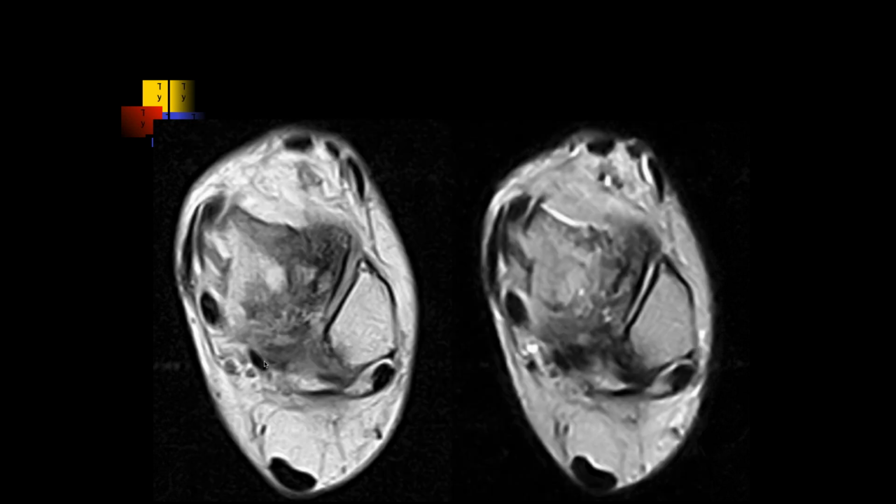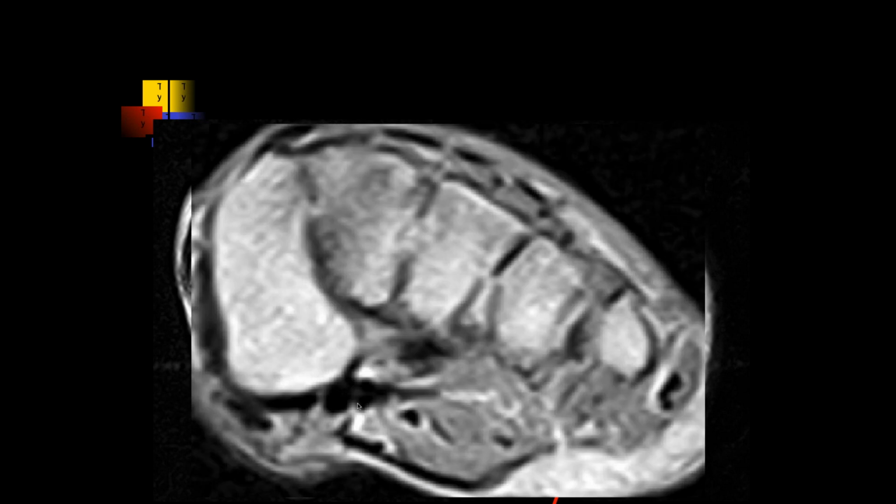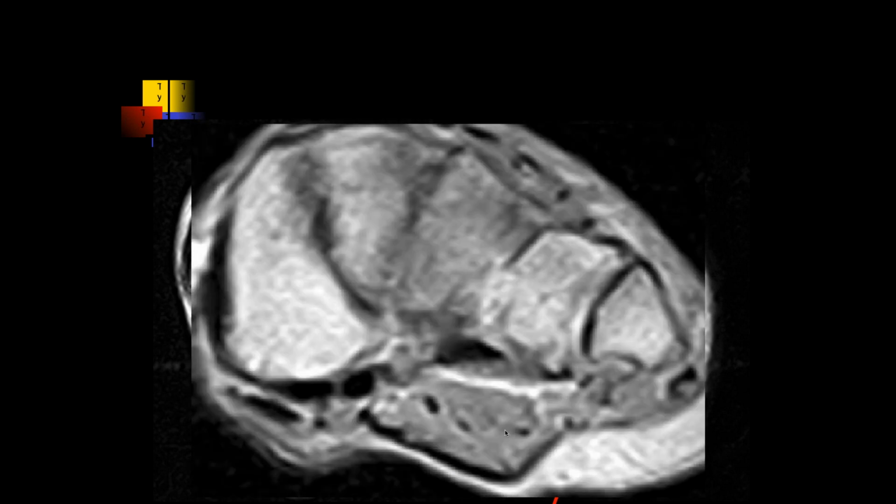Okay, so I'm sorry, let me go back here. So there we go. This is the flexor hallucis longus over here. These are the flexor digitorums. We keep going. The flexor digitorum tendons. Here we go. Flexor hallucis, digitorum, and then when we get up here, we're seeing the hallucis, but we're missing a tendon there. The digitorum isn't here.